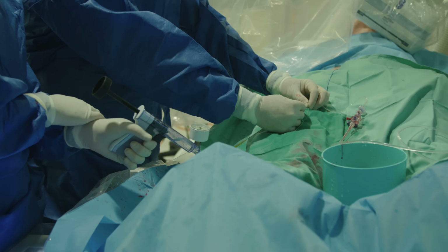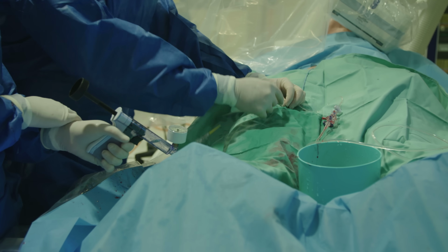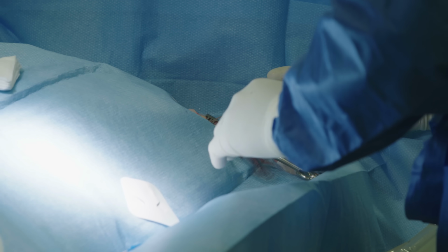But why did we change? Well, it's more convenient for the patient to go through the wrist. Definitely. So it's harder for the operator. You have to be much more skilled as an invasive cardiologist to go through the wrist, because the catheters were all designed to go through the leg. Smaller vessel, isn't it? Yeah, it's a small vessel.